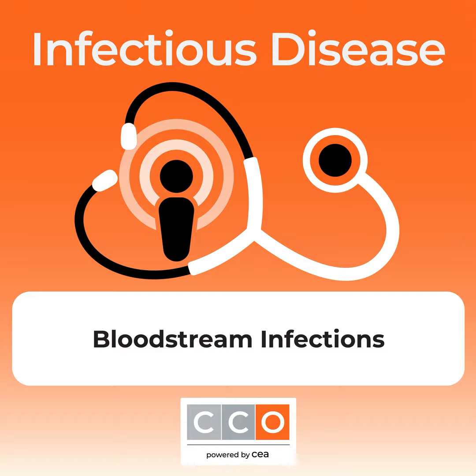There are also several clinical methods to identify microbes by nucleic acid detection, including DNA sequencing, multiplex PCRs, microarrays, and those probe-based fluorescent technologies. So a couple of examples I'll highlight. The BioFire is going to extract and purify nucleic acids from a positive blood culture and perform a nested multiplex PCR to identify bacterial species and certain resistance genes. The Verigene is going to use magnetic beads to capture bacterial DNA to rapidly identify bacteria and resistance gene markers.